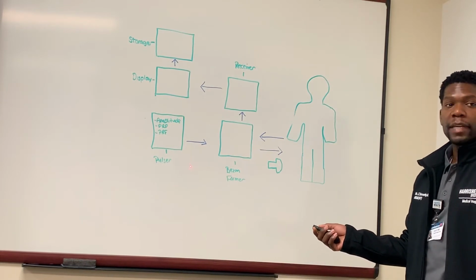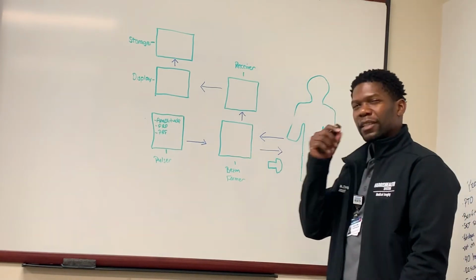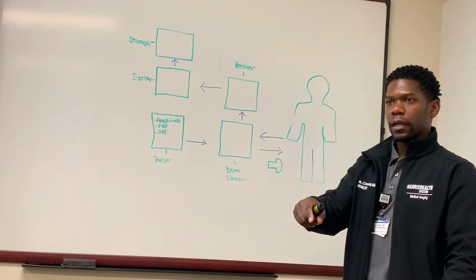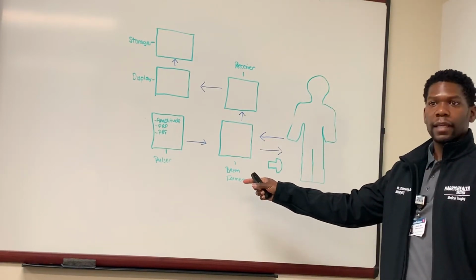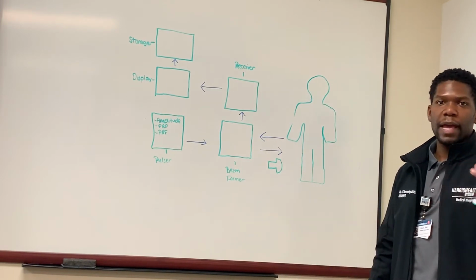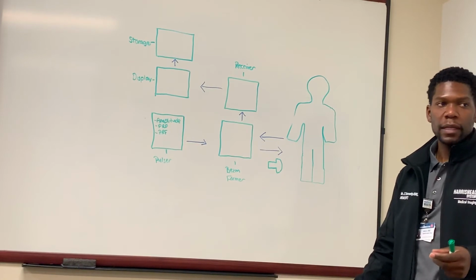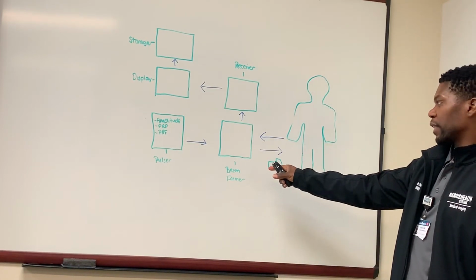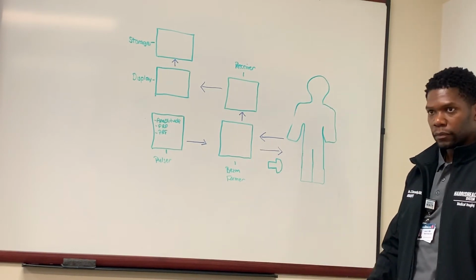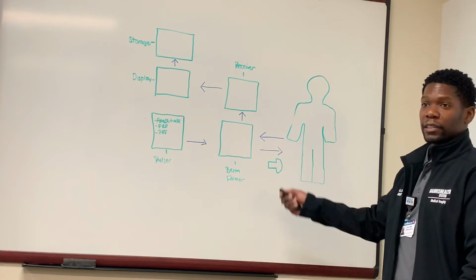That beamformer is going to decide how I want these signals to be distributed among the active elements during transmission. However it decides to do that, whether by apodization, or by steering and focusing that beam, it's going to effectively send the sound waves off to the transducer where the active elements are.